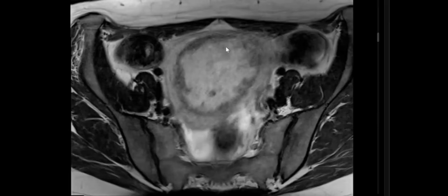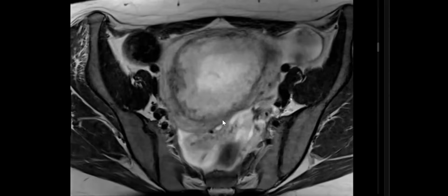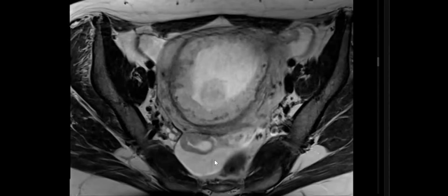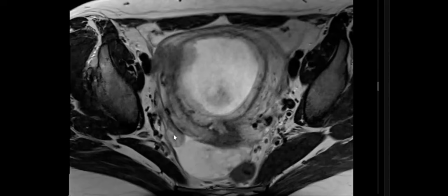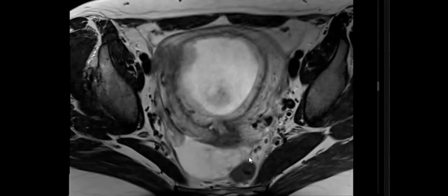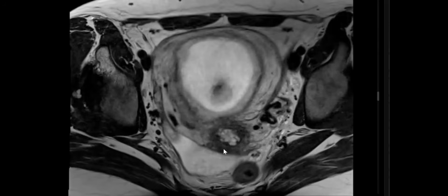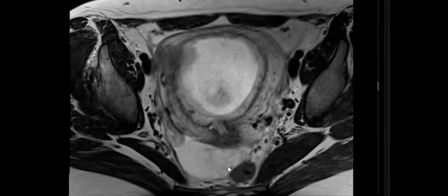But I can see that there is another structure which is just posterior to the gravid uterus, similar to the endometrium. This is the right ovary. Look here. This is the right ovary. You see, normal right ovary. Where is the left? I cannot see. This is the cervix, normal. But what is this structure seen in the posterior cul-de-sac?